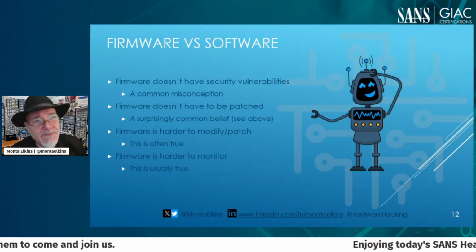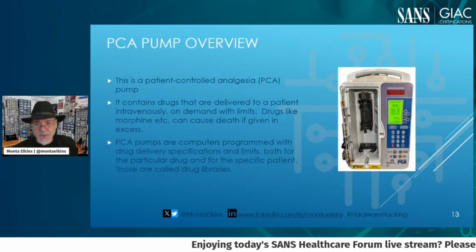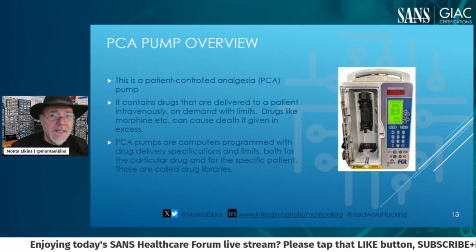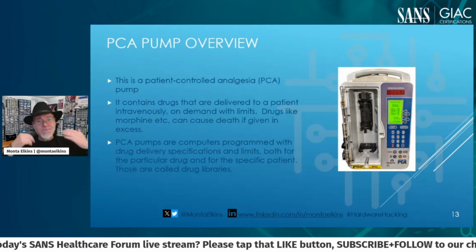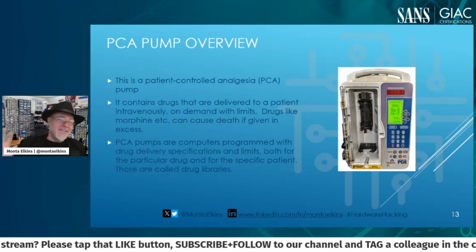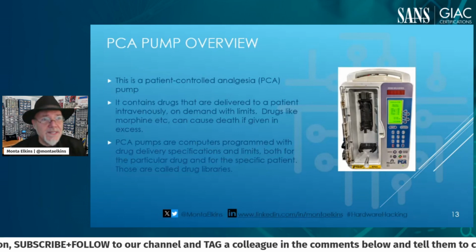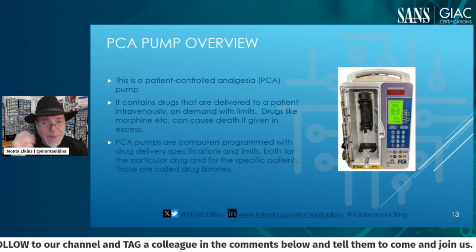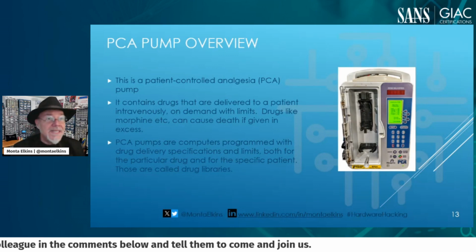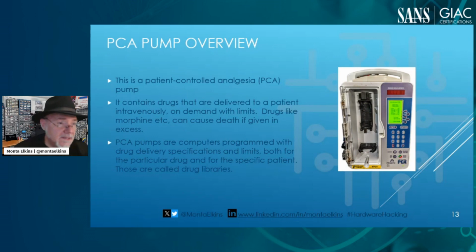But when people say firmware, from a security point of view, just think software. So let's look then, as I promised, a bit of meta-analysis of a particular device. I don't have anything particular against this pump or vendor. It's just a sample device, a demo. They were cheap on eBay because I think they're being replaced with other equipment. But let's look at how you might analyze equipment in this environment.